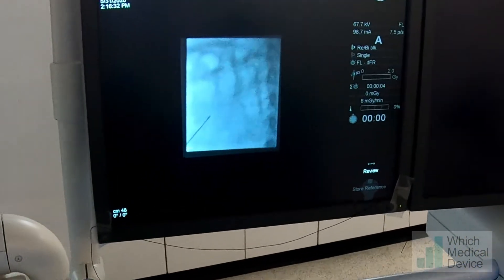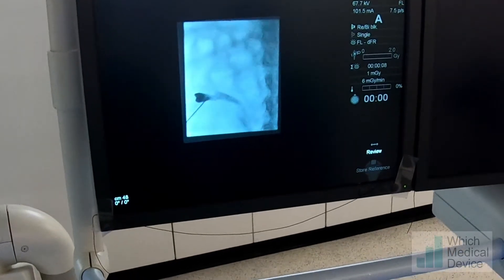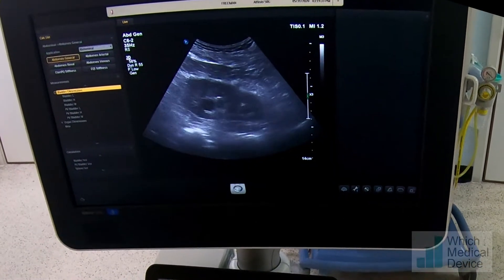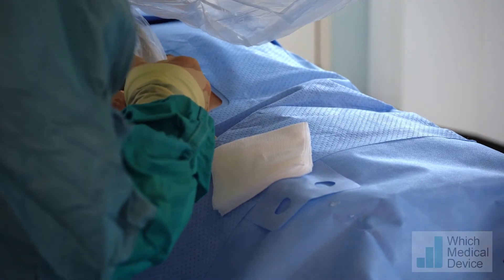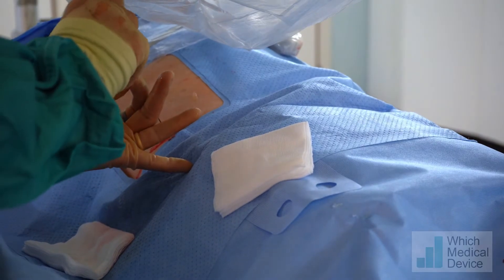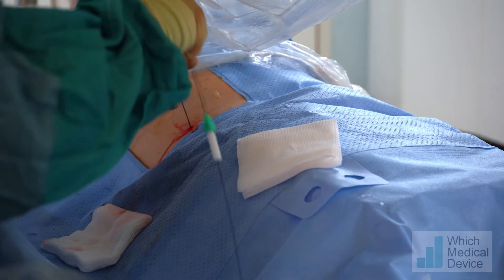Just going to put a small amount of contrast in here. We're not quite in the tip of that calyx — I think we need to reposition this needle slightly. There we go, right in the tip of that calyx. Contrast is going freely down the collecting system, so our wire should go very easily now.